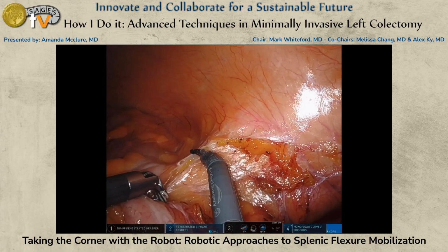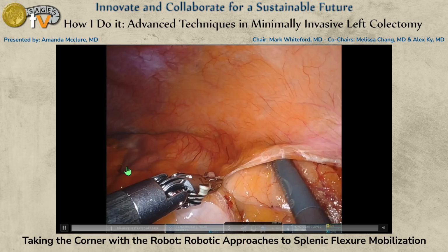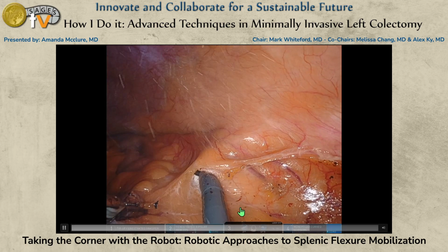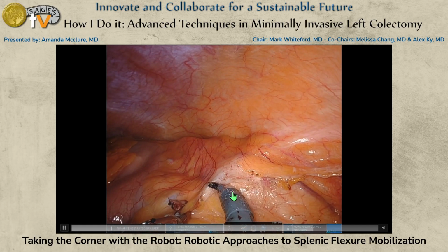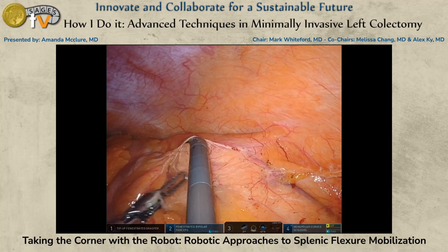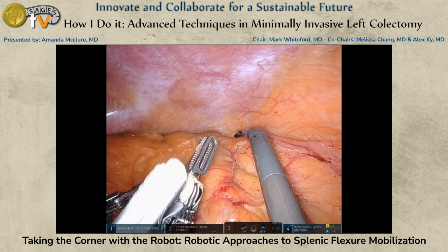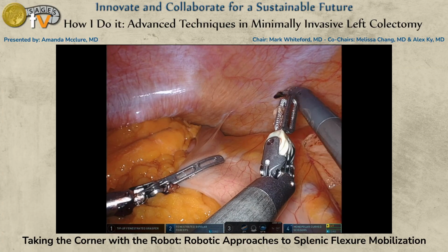So tips and tricks that I've learned over time, really making sure that you're staying ahead and moving in tandem with your arms, and then following that white line. It is so easy to get out of the white line, so really making sure you're in plane. If you're bleeding, you're too deep. So you really want to make sure you're going back to plane always. I operate a lot of times, I'll show you in a second, in angio mode, because you can see the white line really well.